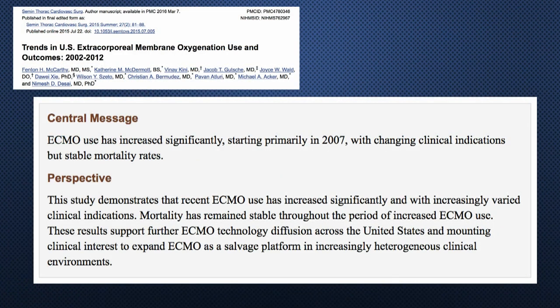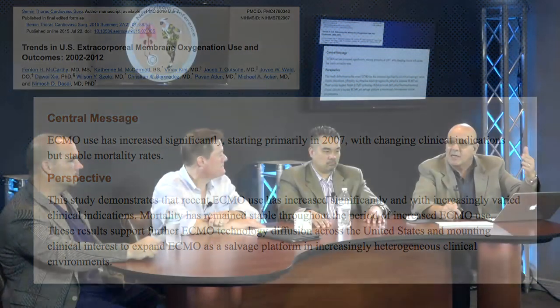What does that mean? It means they are advocating, they are supportive of putting patients on ECMO in further and further out community settings and managing them there, transferring them perhaps, but managing them until they can get them transferred. That it's no longer, we just don't have ECMO capability. They're suggesting, well, that's what I read from it, that this should be far more ubiquitous than it currently is.